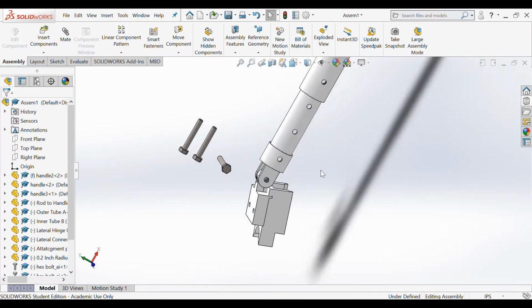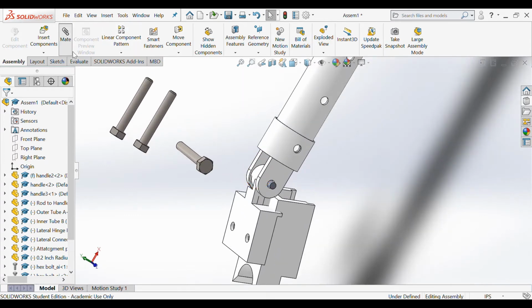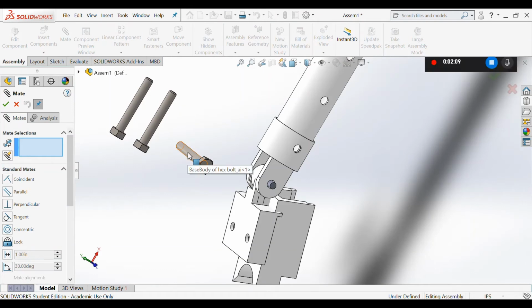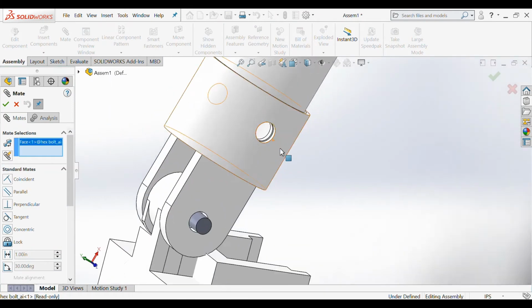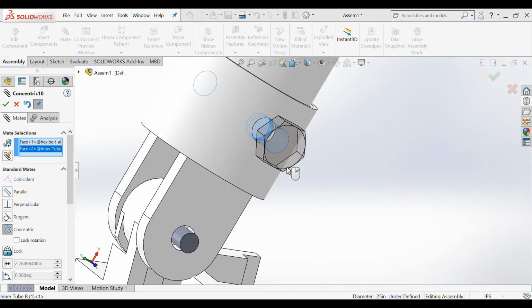So I'm going to go on ahead and start mating these guys. So I'm going to click on mate. I'm going to click on the outer surface of the bolt, and I'm going to choose the inner surface hole of this hinge. And I'm going to make them concentric.